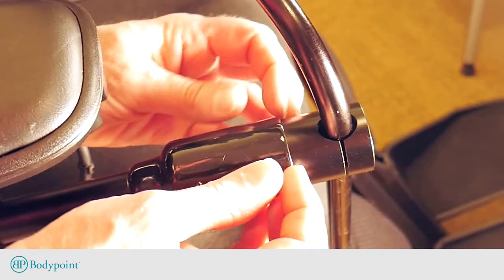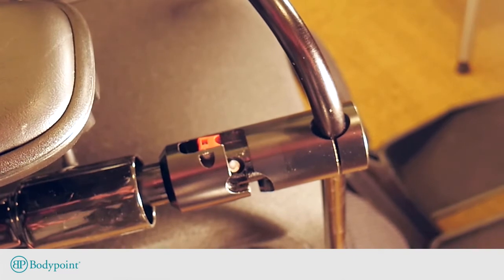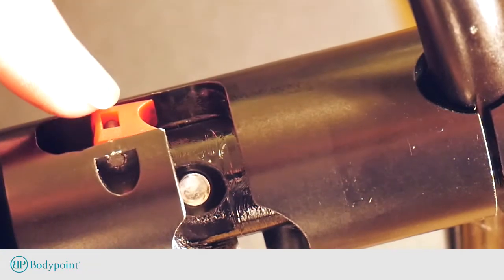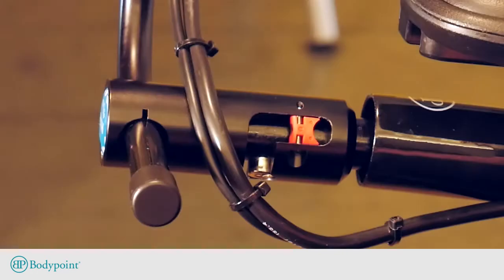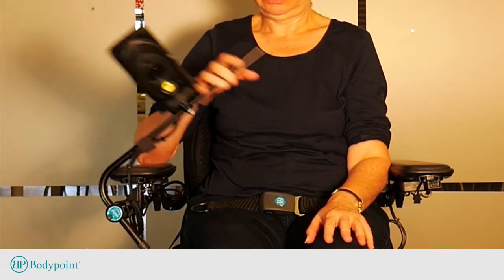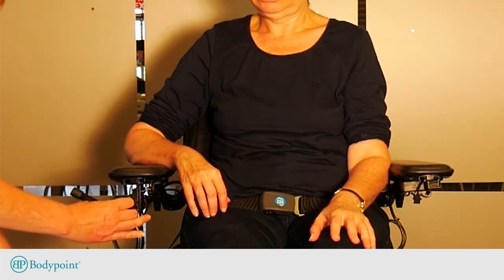Pull back on the rotating shaft rubber sleeve to reveal the red flipstop. There are two flipstops so you can install on either the left or right side. The position of the flipstop determines if it is set to independent or assisted release. Flip the flipstop that is closest to the screw head in the driving position. With the concave end facing the screw, it is set for independent release, allowing the user to flip the arm 90 degrees for transfers and activities. Either the user or caregiver can further pull in on the shaft to swing it completely out of the way.